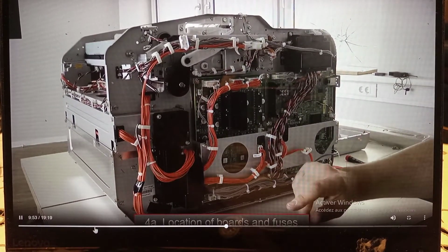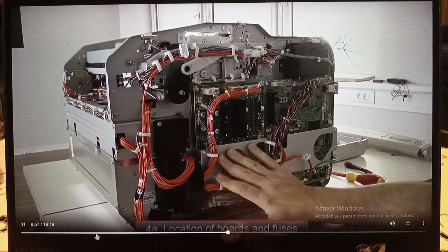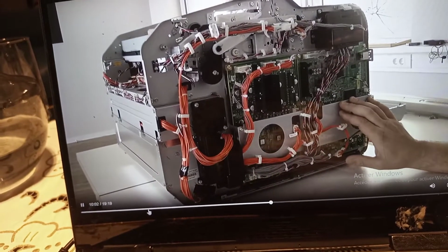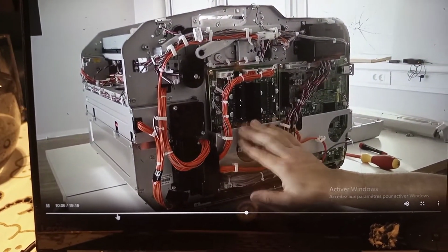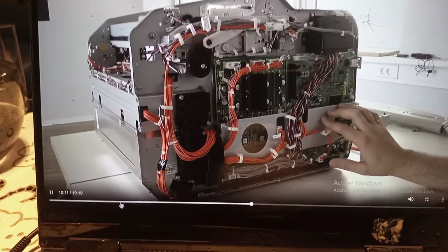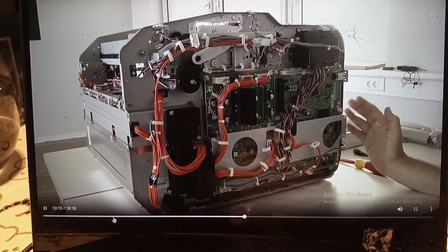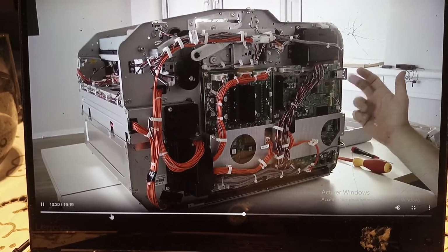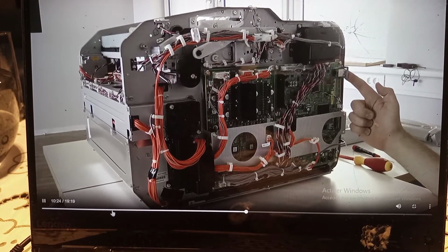Here we can see 2 boards. On the left side we have the sensor board, and on the right side we have the CPU board. So on the sensor board all the sensors are connected and the power supply will also be distributed. On the CPU board the image unit is connected, the machine data is stored, and the connection to the console software with the network connection is available.